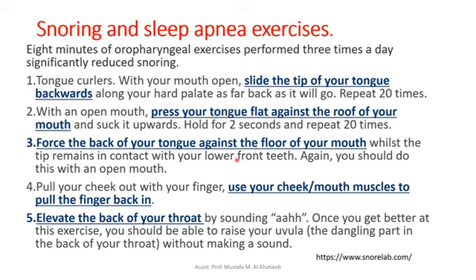Force the back of your tongue against the floor of your mouth while the tip remains in contact with your lower front teeth. Again, you should do this with an open mouth. Pull your cheek out with your finger. Use your cheek and mouth muscles to pull your finger back in.